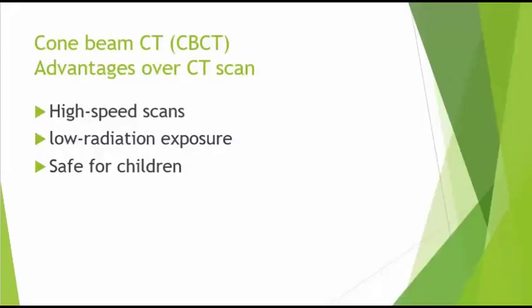CBCT has certain advantages over CT scan. The first one is high-speed scans. It takes less than 30 seconds. Compact and reduced size of the device makes it feasible for use in a dental office. High spatial resolution applicable for maxillofacial diagnosis, and we have low radiation exposure, 10 times less than that of the regular CT scanner. And also it is safe for children.